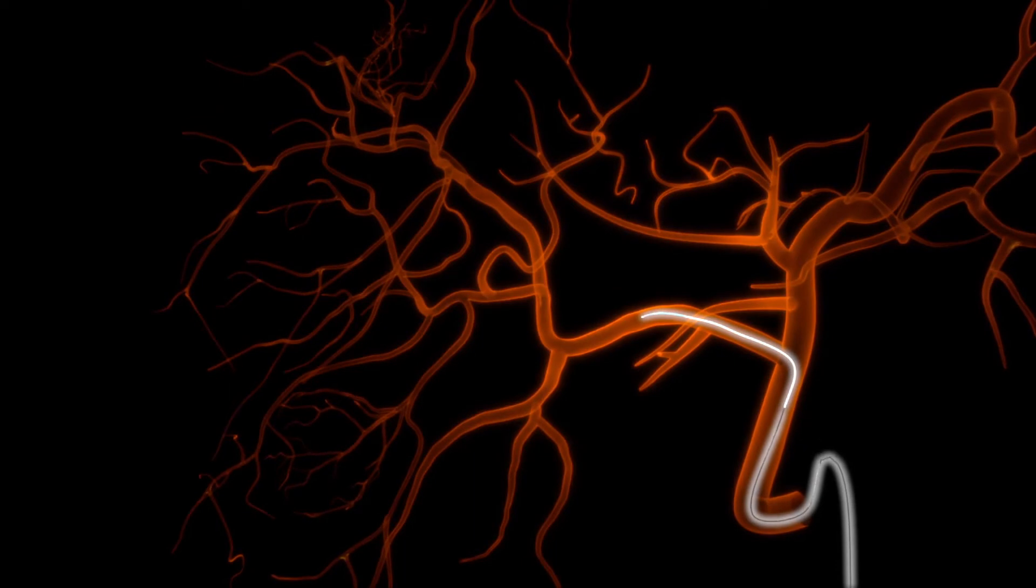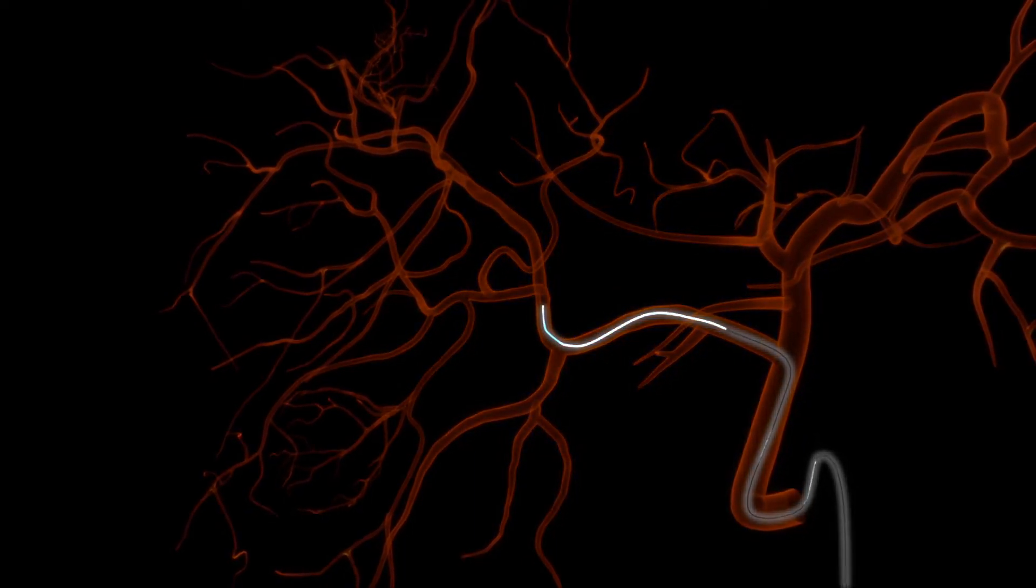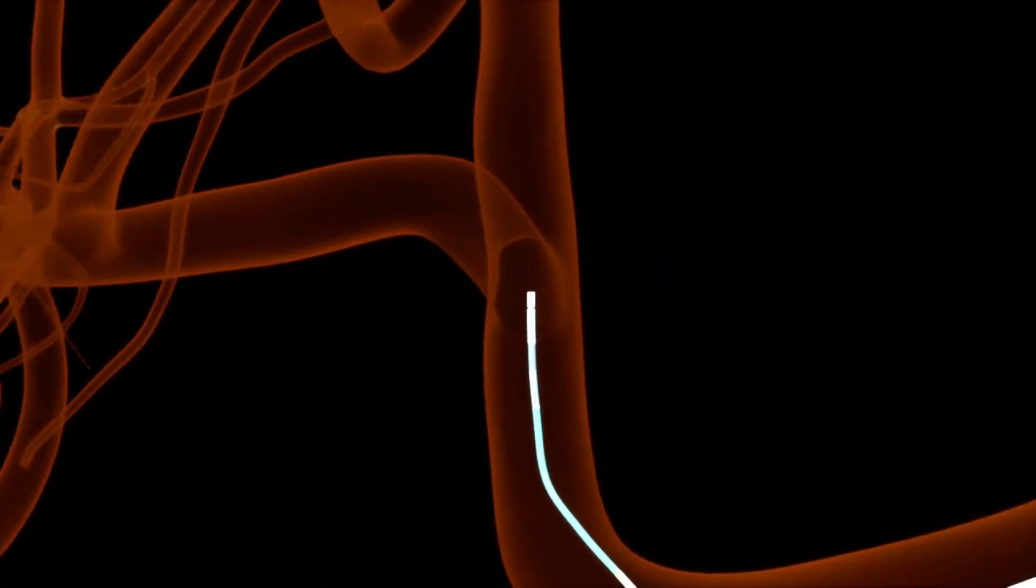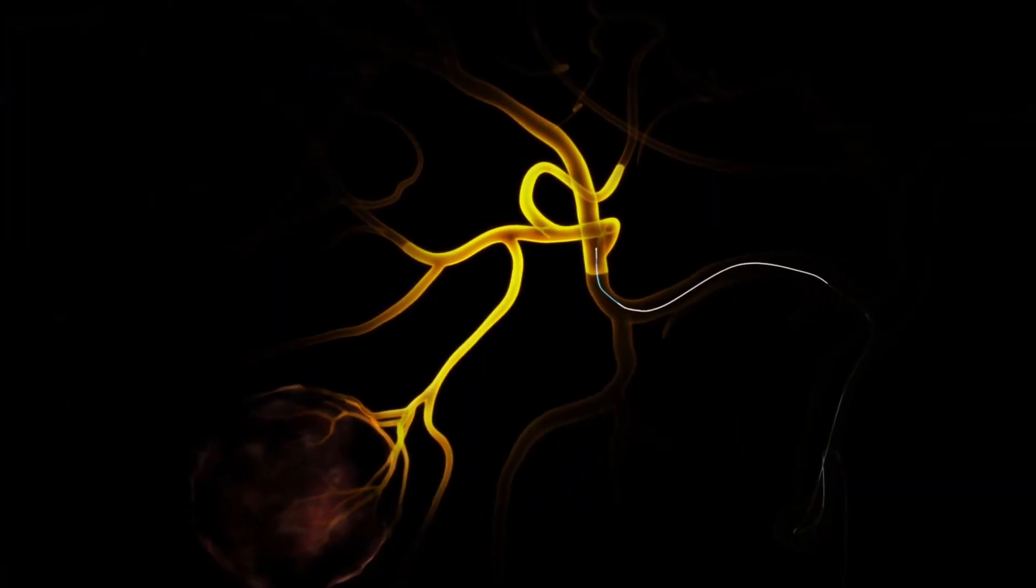While watching under fluoroscopy, carefully advance the Swift Ninja through the vessels. The tip may be articulated to the same angle of the vessel branches to help direct the guidewire and Swift Ninja through the vasculature.